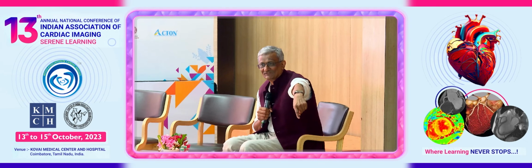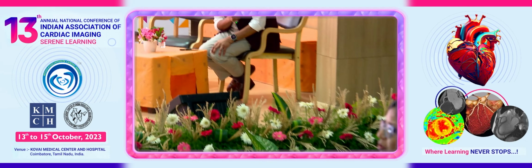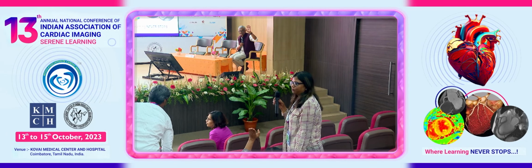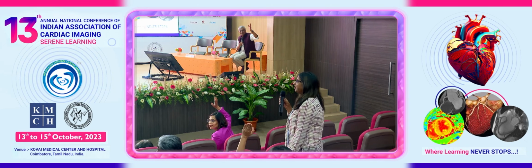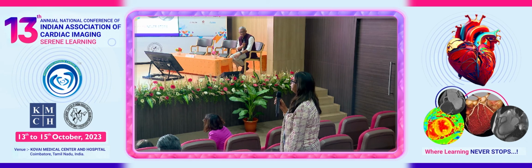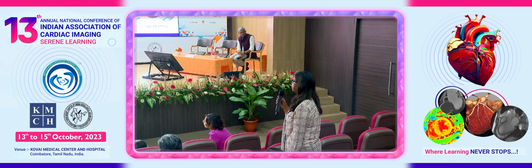You have a question. Go ahead. So how many of you are following CAD-RADS 2.0 in your reporting? I am, but generally I'm asking. Let's get a raise of hands if you're following CAD-RADS 2.0 in your report. That's a good number, I'm happy that we're doing that. Have any of you come across reporting HRP and plaque burden? We have an automated, semi-automated kind of software, and we try to report a plaque burden. So quantitative, should we do it? Should we not? Does it make a difference in real practice till now? Have you come across any case like that?